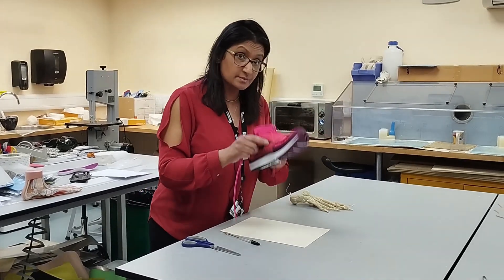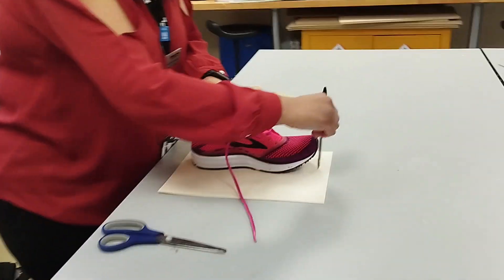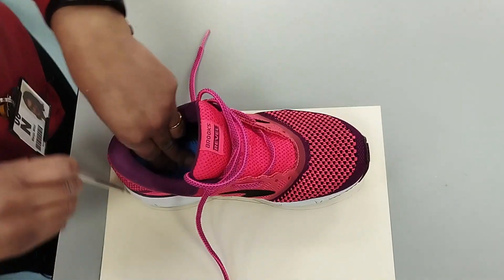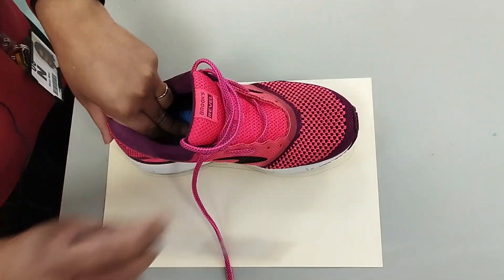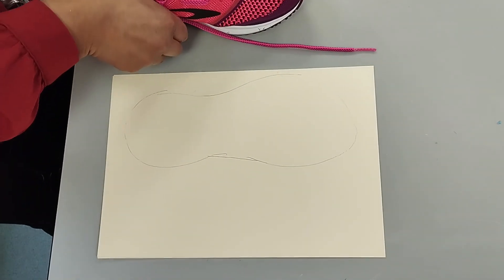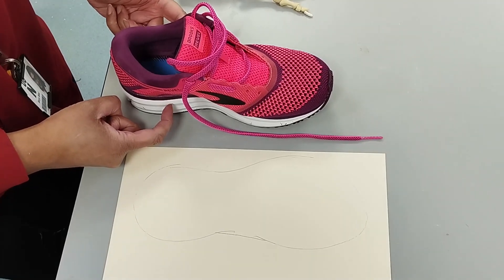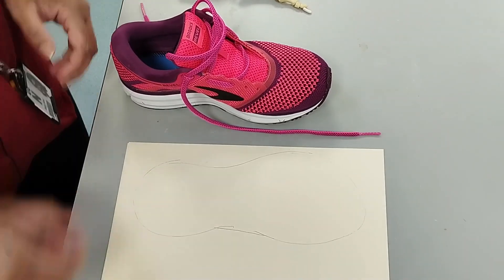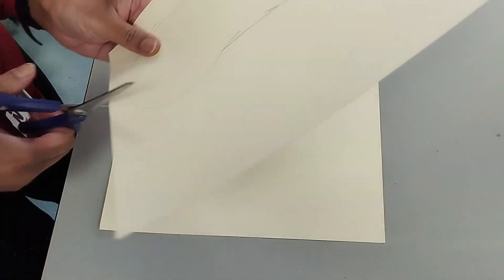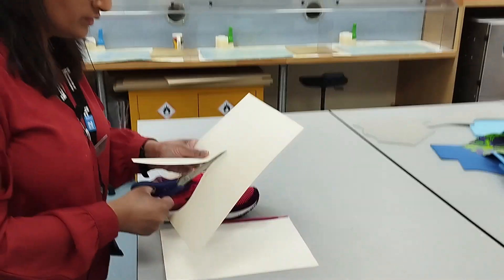How then would you take a template for the shoe? You place it onto a piece of cardboard and draw around the trainer, keeping the pen completely vertical, going all the way around. As you can see, it's quite wide, so you need to gauge where the inlay comes in — it's a good centimetre on both sides with this trainer. You then cut around the template, approximately a centimetre in, all the way around.